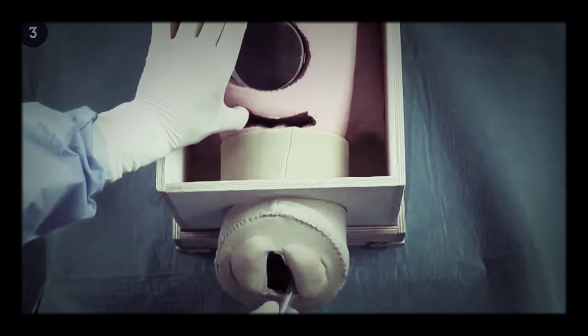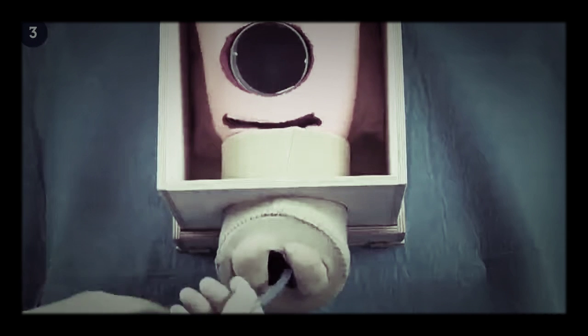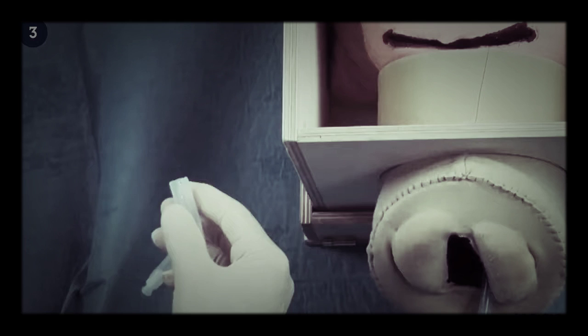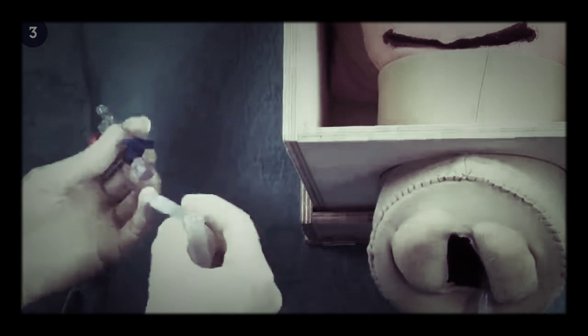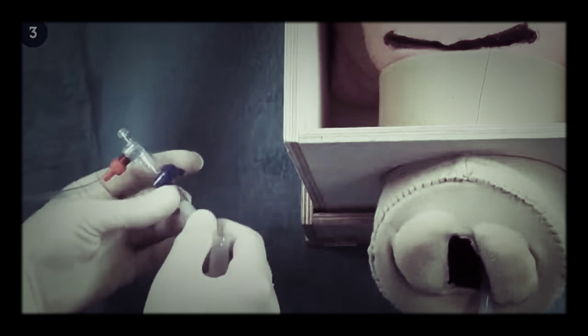The uninflated balloon is passed through the caesarean incision into the uterine cavity. The inflation port is pulled through the vaginal canal until the base of the balloon reaches the internal ostium. The drainage port and inflation port are separated again and the giving set is connected as previously shown.